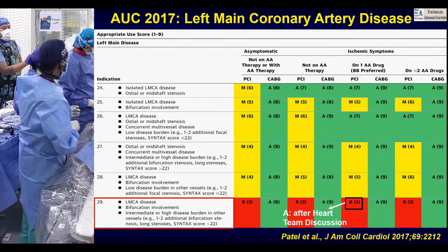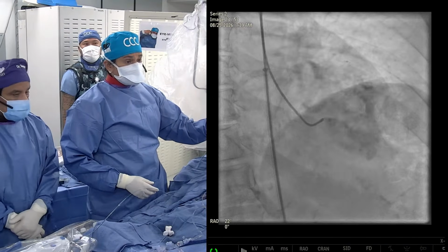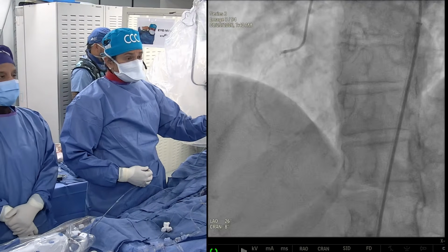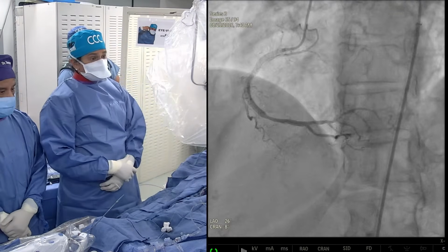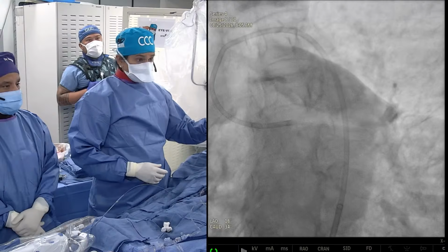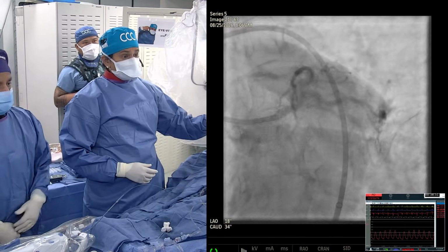So Anu, tell us what's happening. Let me just go back here. Yeah. So this is the normal EDP. EF is good. And look at the calcium on the top. Yeah. This is the RCA now. Looks beautiful. And same, dry cine. Tram track calcium, left main.